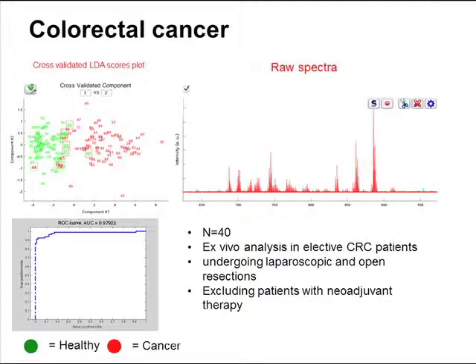I'm a colorectal surgeon, so that's what I'm really interested in, and what we're really trying to push is translation applications in this field. We've submitted our data to ACS, and I very much hope we'll be able to present it there to you. But this is hot off the press from one of my PhD students' work, which we pushed through in time for this presentation. But what you can see there is a mucosal sampling of 40 colonic cancer patients.